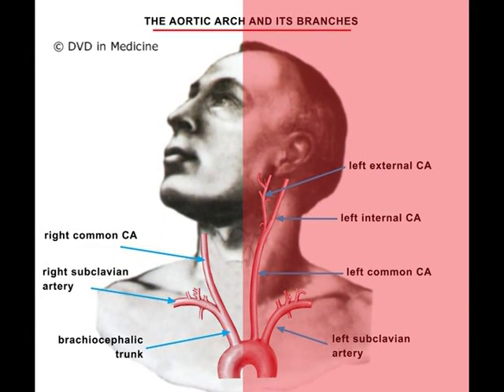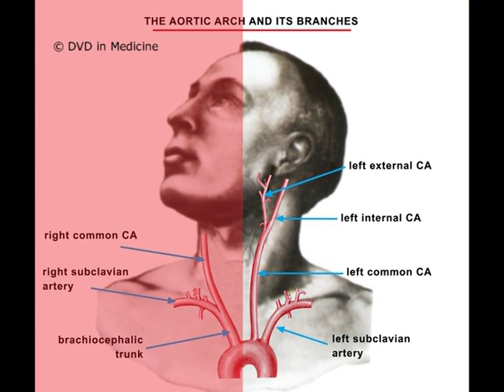After one has identified the course of vessels on one side of the neck, the same procedure must be performed on the other side.